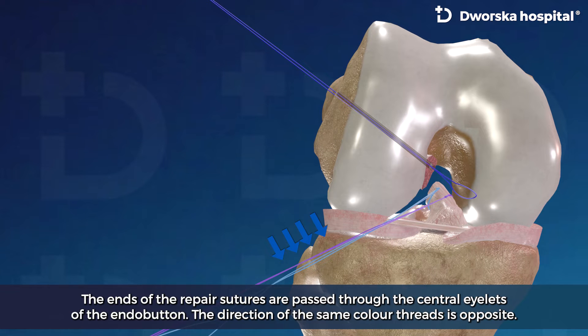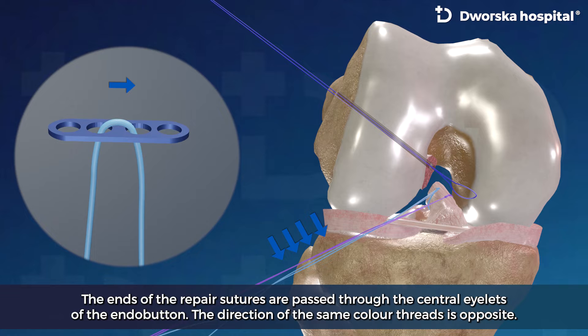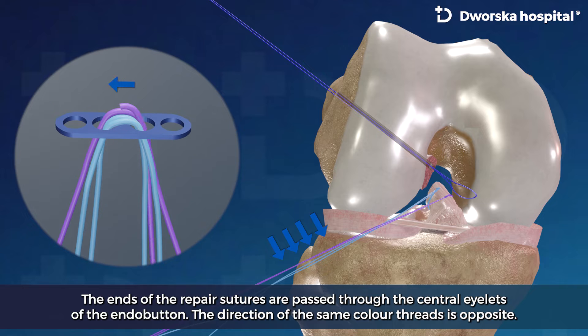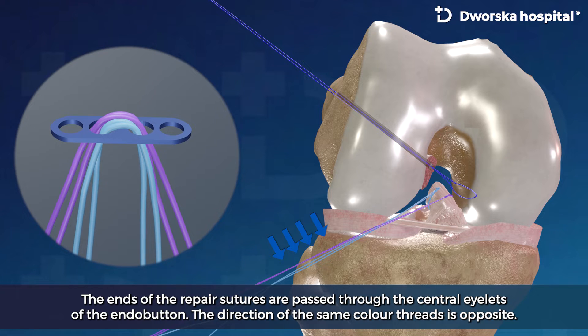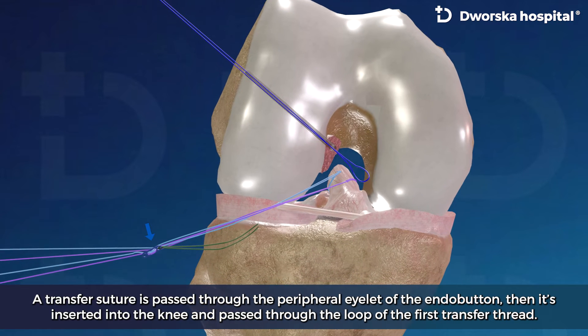The ends of the repair sutures are passed through the central eyelets of the endobutton. The direction of the same color threads is opposite. A transfer suture is passed through the peripheral eyelet of the endobutton.